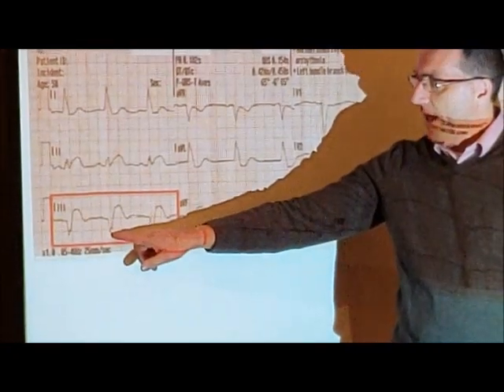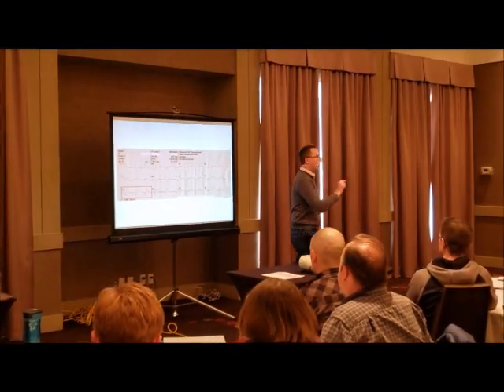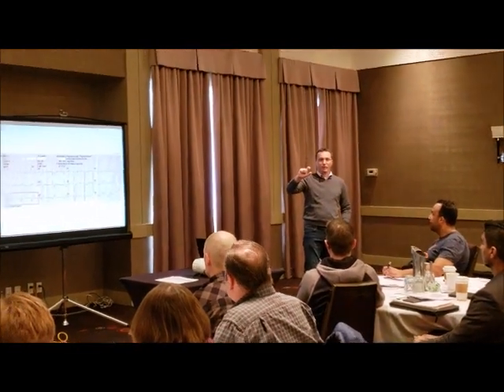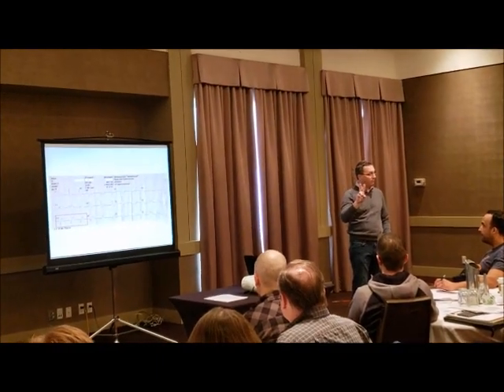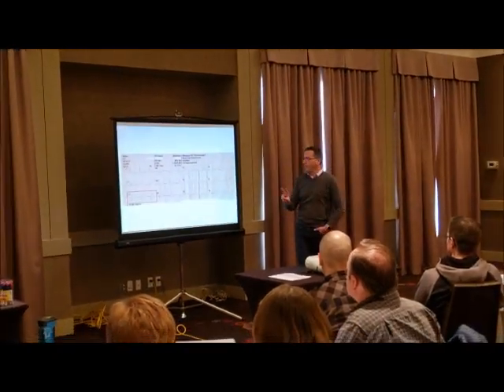So we have about 7.5 millimeters. I'm going to call that 2 large blocks of S-wave depth, because I round up. That means I will allow 2 millimeters of ST segment elevation in that lead, but not 3. Okay, that's how I adapt Smith's modification for field use.